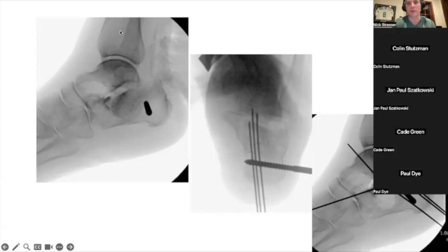Jan, I saw somebody on social that showed using two K-wires on the medial side and then just swapping these for two-seven screws, because a two-seven screw is often the same core diameter as a two-K-wire. I kind of like that idea, although that's maybe easier said than done. You could use a cannulated screw, which I think is what I ended up using in this case, and that's probably just technically a little bit easier.